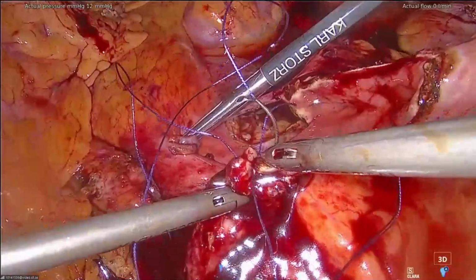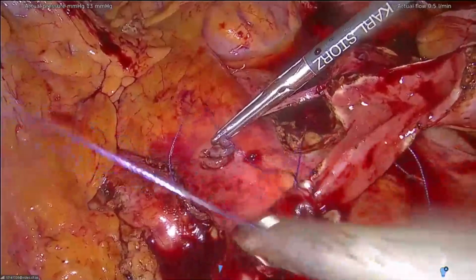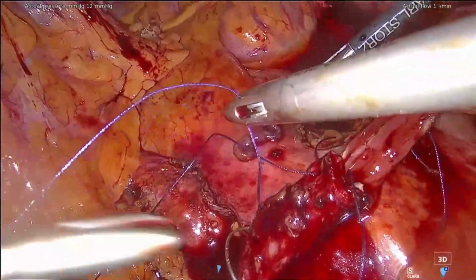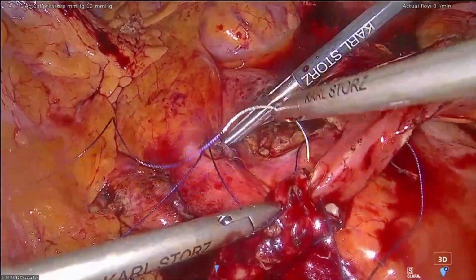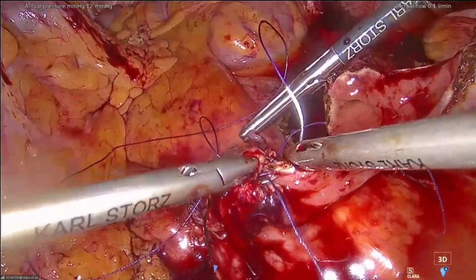But will you fix this anastomosis to the mesenteric peritoneum or not? I don't need to. The only question is, since we don't pass under the meso, what about the risk of bowel occlusion under the bridge? That's the only concern. Yeah, this is a good concern. But I don't believe that because I put one stitch I will avoid that. I should incise the peritoneum completely to extraperitonealize the ureter, but it will be very difficult to do.